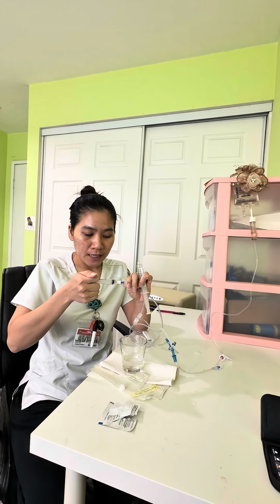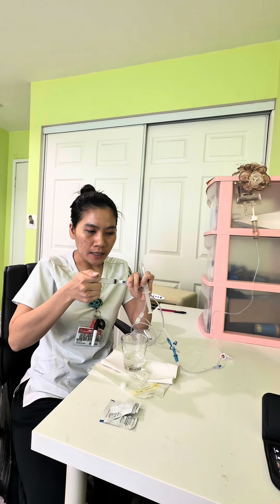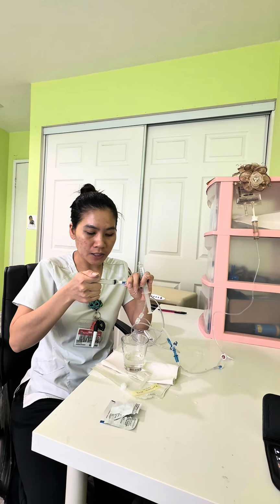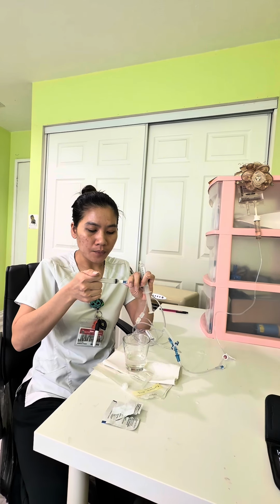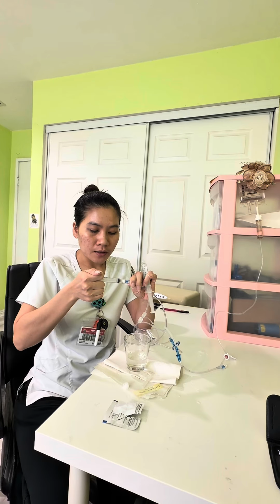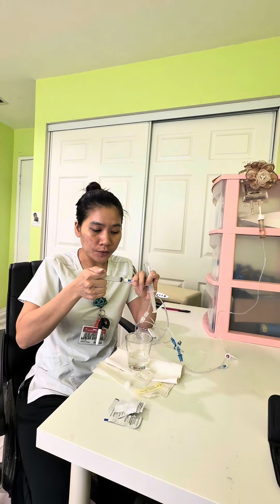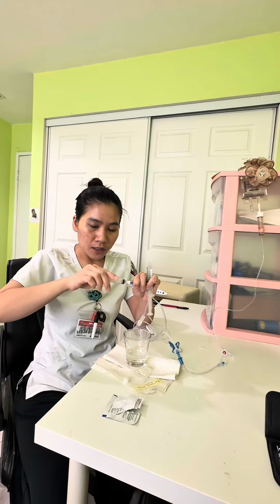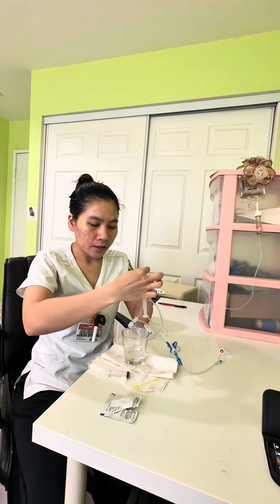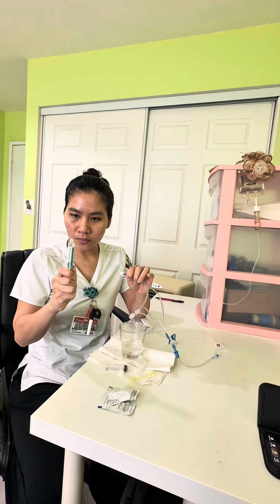While I give the patient medication, I also assess the IV site for any sign of redness, swelling, or infiltration. Also I inform the patient of the purpose of the medication and the side effects. Since it's furosemide, I also inform the patient to increase potassium supplements since it removes potassium from the patient's body. After finishing giving the medication, I go ahead and flush the tube one more time to make sure all of the medication goes into the patient's body.